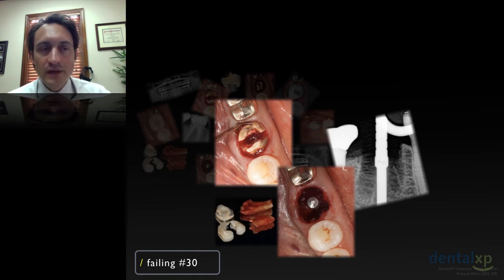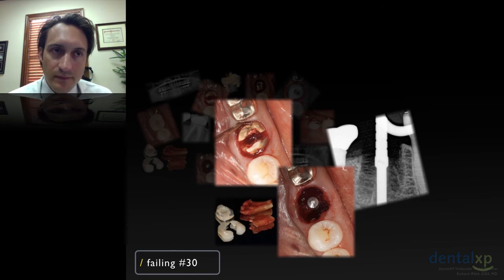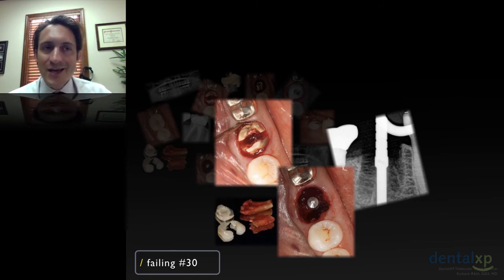Once I place the positioning cylinder, I will often take the bite block out. I'll have the patient close. I'll make sure that this is going to be occluding with the ideal place along the maxillary lingual cusp of the maxillary molar. If a patient has first molar occlusion, you'll know if this is in the right position. Also, I take these check radiographs. I find them very valuable when I'm doing any implant procedure, but especially immediate molars.